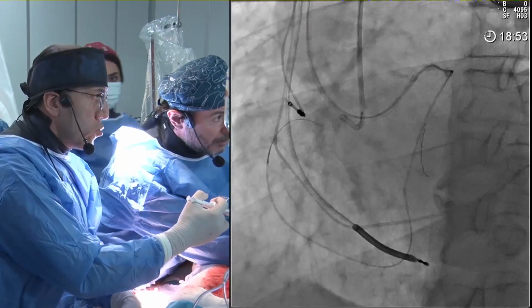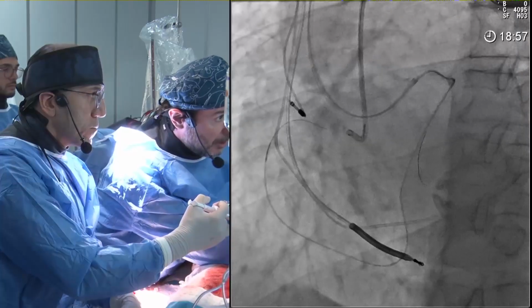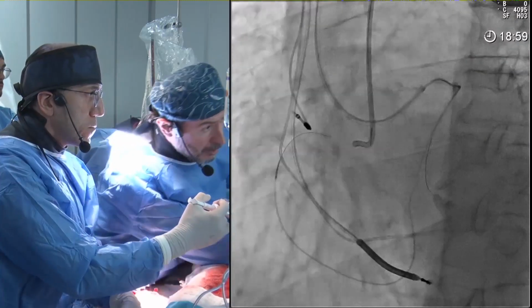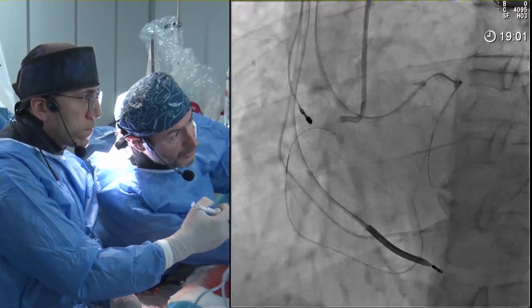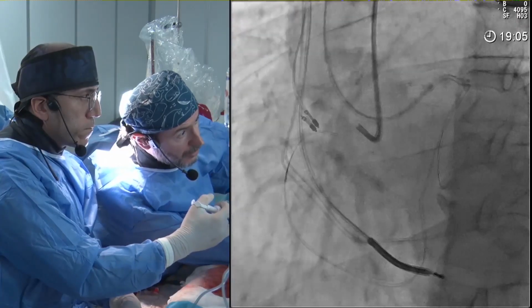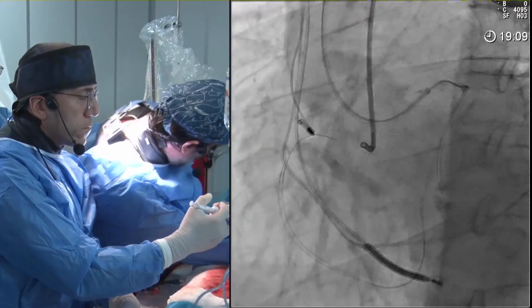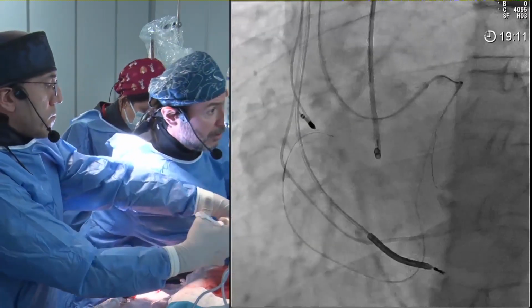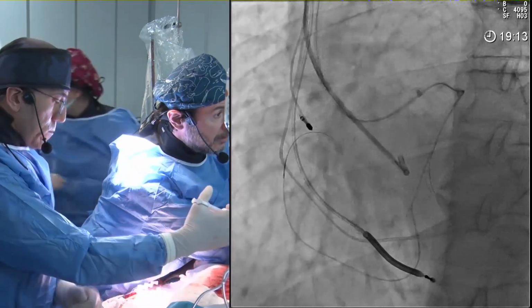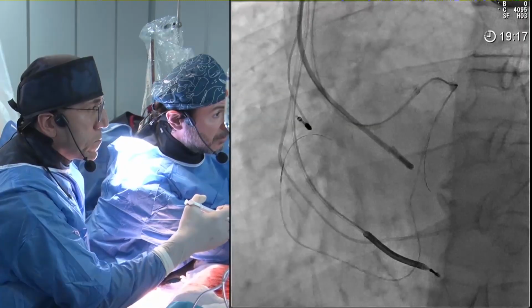Just one comment. He has a coronary CT. He has done a coronary CT for this right coronary. So a good analysis of the CT, and if he can integrate this result of the CT with the angiography, it will help in directing the wire from retrograde, and help also in choosing the guiding catheter, which one will be more aligned with the right coronary. I think here the CT is very crucial in such a patient.